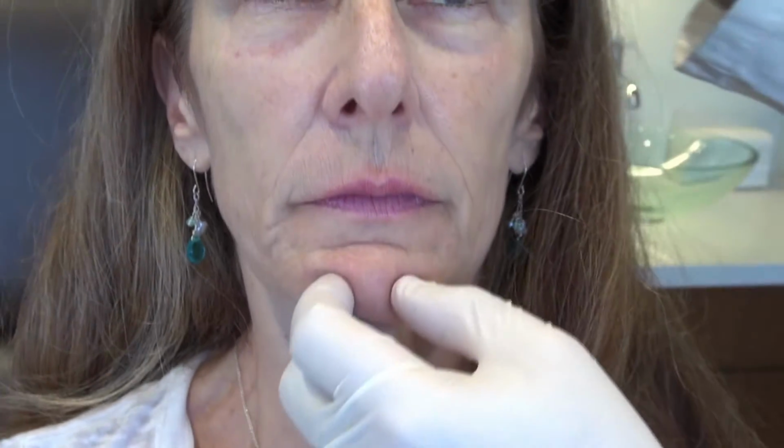What I'm not shooting for is to have a completely smooth transition between her lower lid and her cheek, because here she has some herniated fat that you can see through the lower lid. We're not going to be able to really blend that completely in. She's still going to have a little bit of fat visible pooching out, but this will be at least a smoother transition, if not a perfectly smooth one. Okay, let's go back.